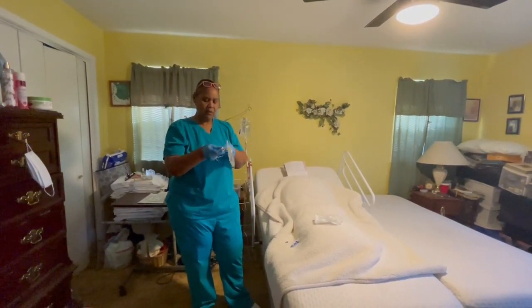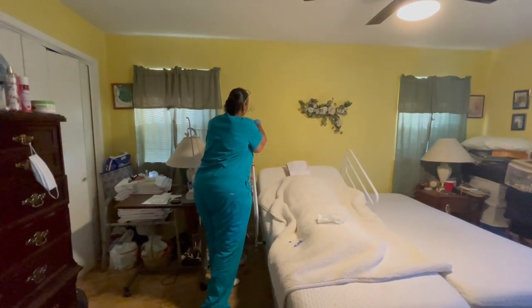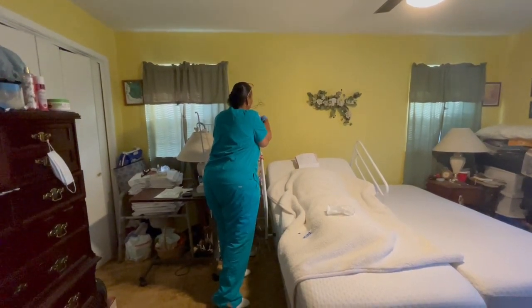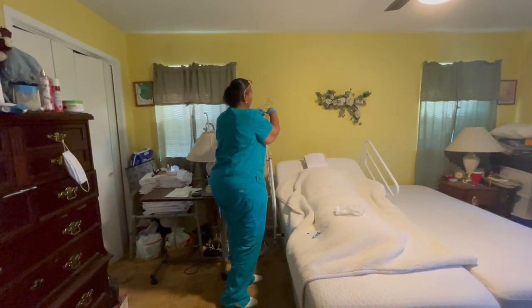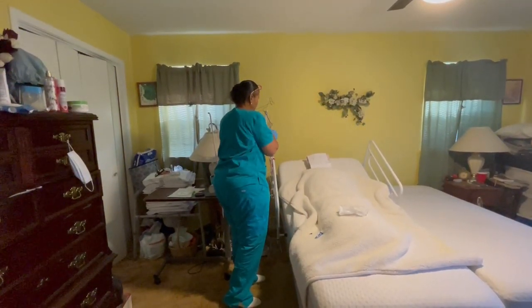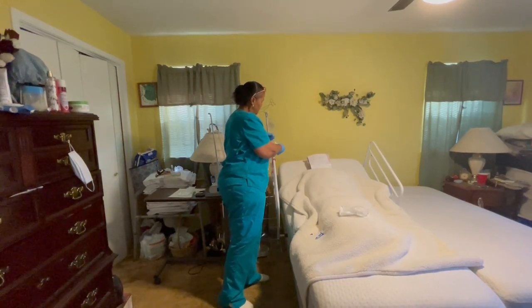I'm going to close my clamp because I don't want it to drain everywhere. I'm gonna hang this up here, if I can get it to stay. There we go. Once I got that, I'm gonna go ahead and make sure I have my IV and everything ready. My secondary, so I won't forget it. I'm gonna hang this down for gravity purposes. Okay, I'm going to prime my secondary.